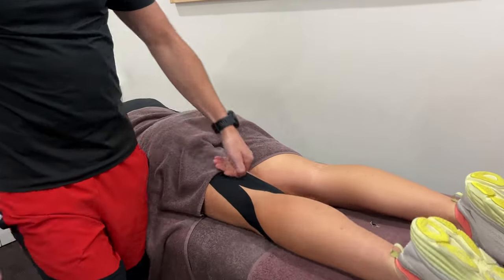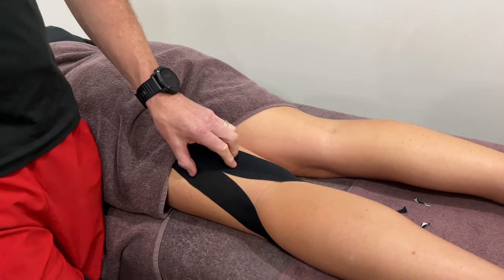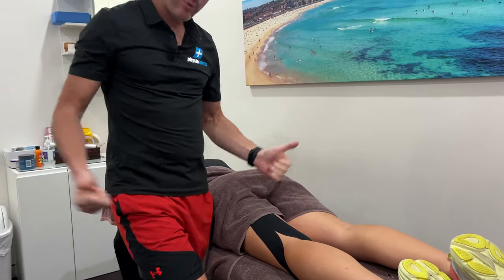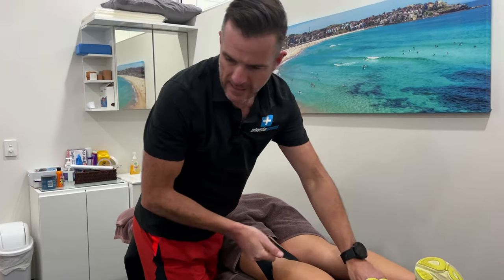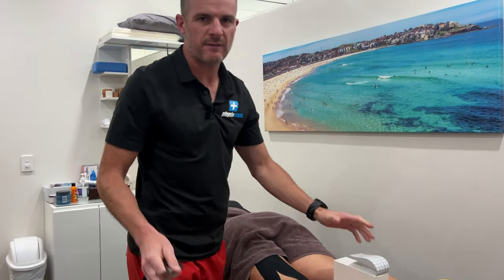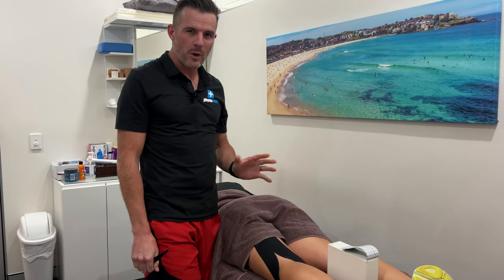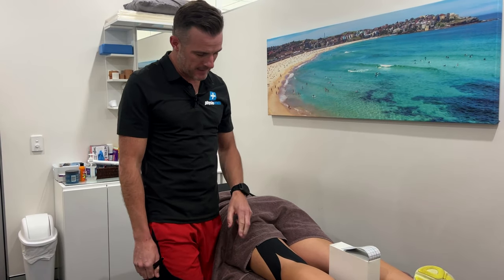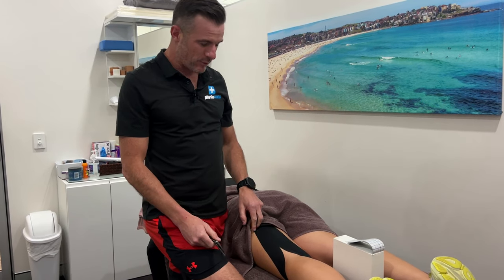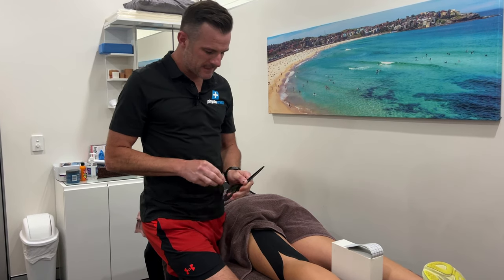Happy days. There's your two medial, one lateral hamstring taping, which is going to work really well. You'll probably find it's really helpful — they can feel that support when they're running. If they've got a hamstring tear that you've diagnosed and confirmed, you've rehabbed it, it's coming back to almost normal — sitting around 90% — and they are training, you can protect that tear a little bit more. Some of this is a bit of a placebo because they can really feel the support there, so it helps them relax a bit more.